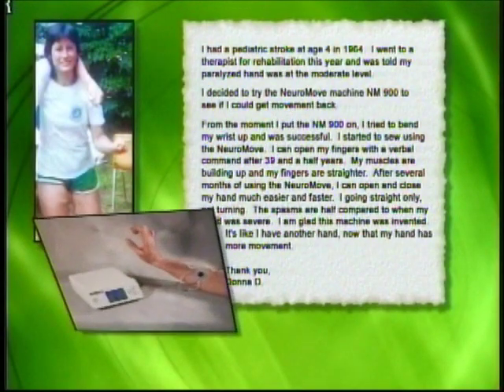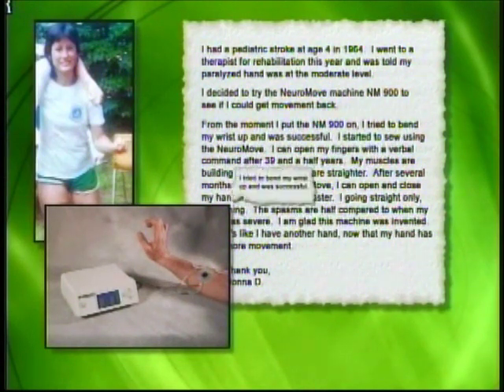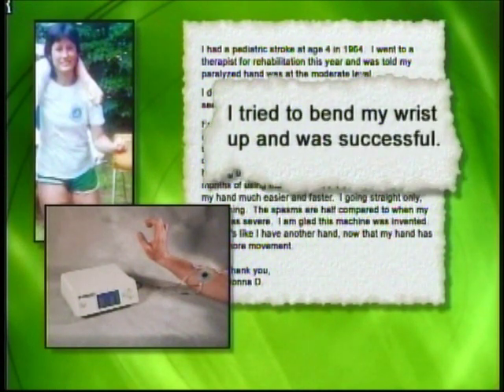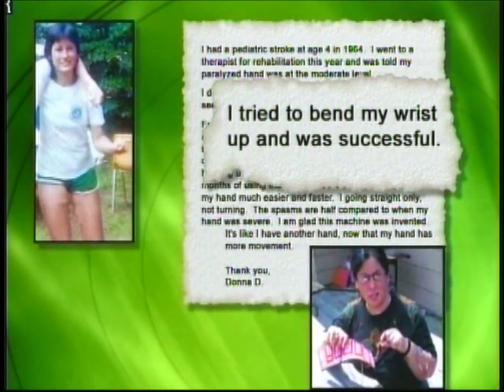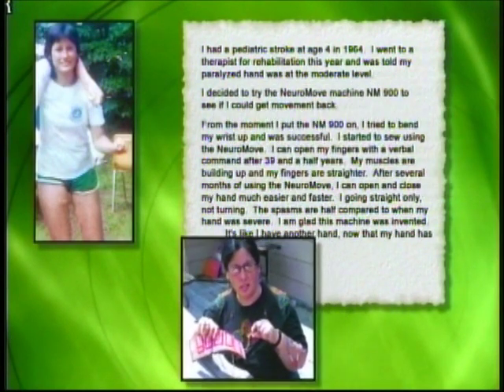At the left side of my body I could not walk, could not use my arm. It took me about six weeks to learn how to walk again, still working on my arm. I decided to try the NeuroMove NM900 to see if I could get movement back. From the moment I put the NM900 on, I tried to bend my wrist up and was successful. I started to sew using the NeuroMove, and after 39 and a half years, I can open my fingers with a verbal command.